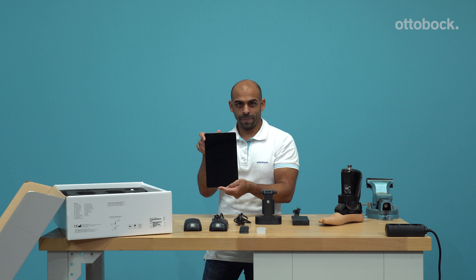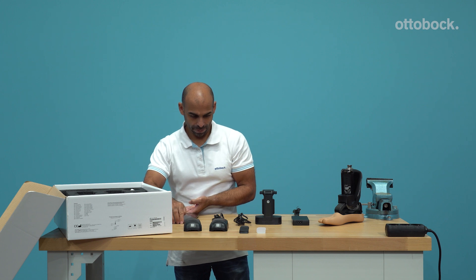Please install the Empower setup app on the optionally provided tablet. In the app, you will find the instructions for use of Empower. Depending on the country of delivery, it may be physically included in the package.